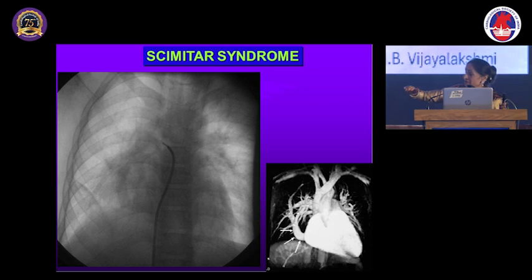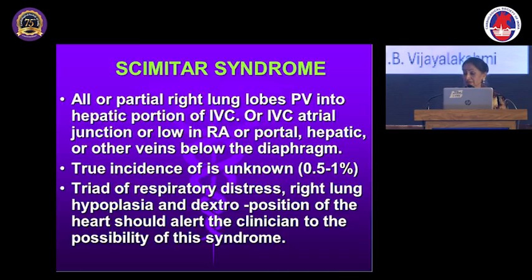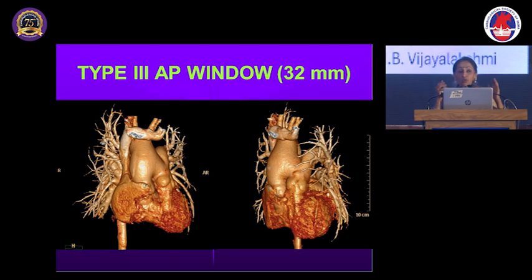So whether it is an X-ray or echo or angio, the figure of 8 is a classical picture. But what is important is, with the echo you can make the diagnosis, but you cannot make out the saturations, and more than saturation, the pressures. So why it is important to go into the vertical vein and then take a pullback tracing is that a hemodynamic vise will be there.